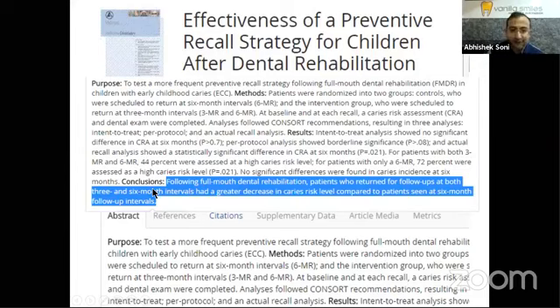This is a 36-month follow-up wherein the strategically important second primary molar eventually gave in, but the first permanent molar had erupted, so we shifted to a reverse band and loop space maintainer, and that's the 48-month follow-up. And all of this happens with motivated parents.